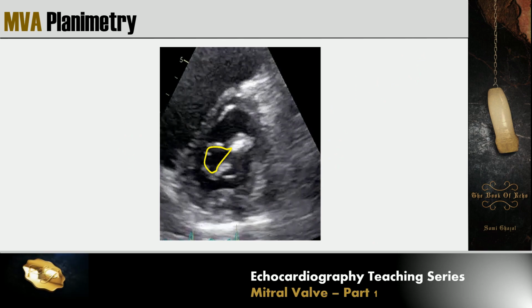So again, the mitral valve apparatus is more like a funnel shape, with the smallest orifice usually at the leaflet tips. Therefore, planimetry must be performed at the leaflet tips. In 2D planimetry, the mitral valve will be taken in short axis and should be obtained with a careful, slow sweep to view the smallest mitral orifice area, and then tracing of that area will follow.